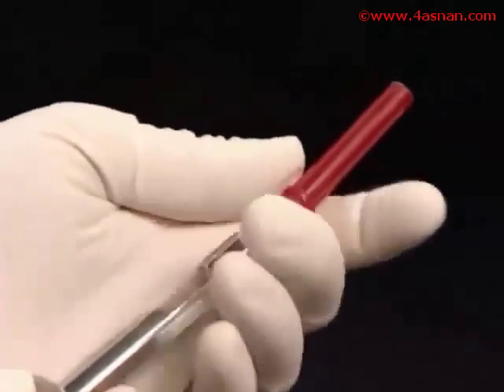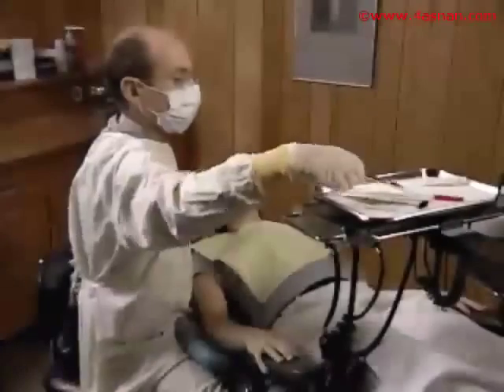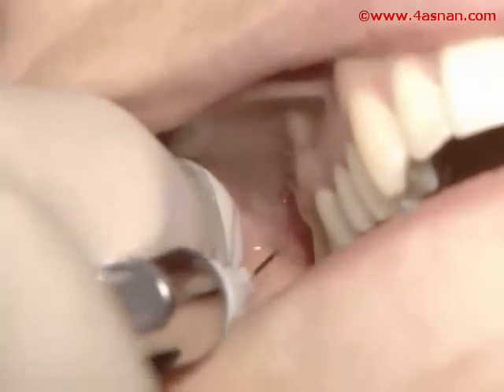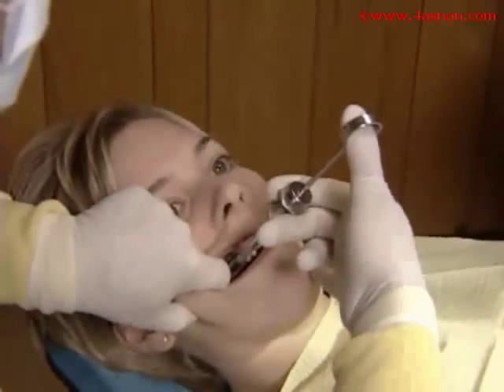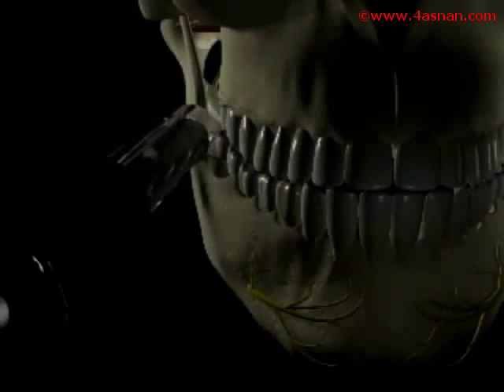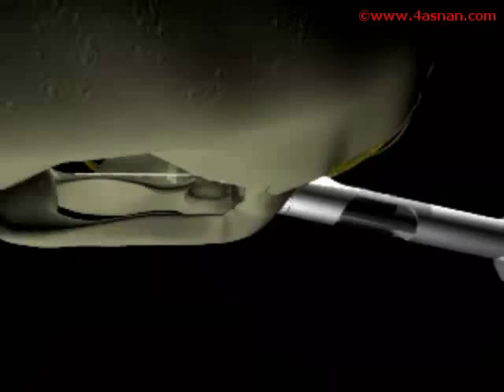To bend a needle, what you need to do initially is loosen the cap, and then using the cap in a sterile manner, give it one bend and one bend only, removing the cap to determine the final degree of bend. With the jaw closed and the teeth together, the syringe inserts into the insertion point against the posterior mucosa. Once it's advanced in, the angle is corrected, and the needle is advanced back posteriorly 25 millimeters.